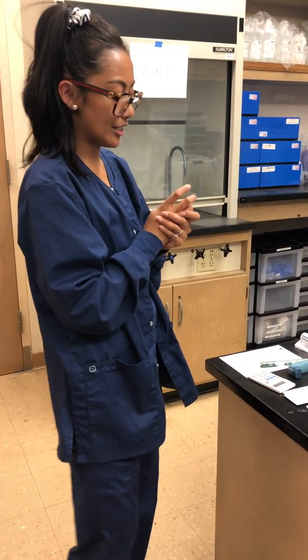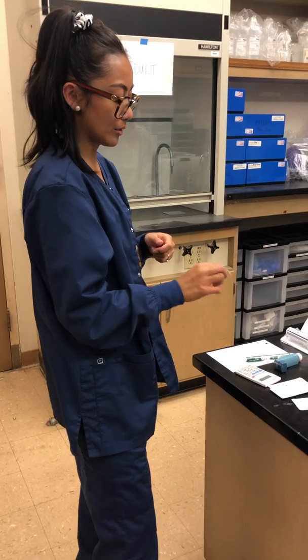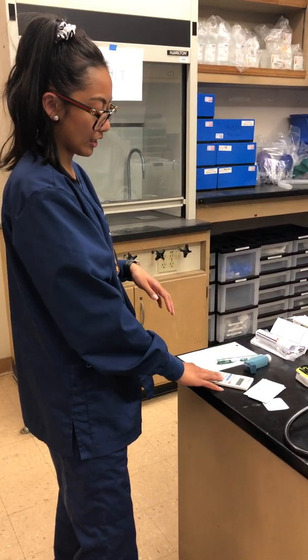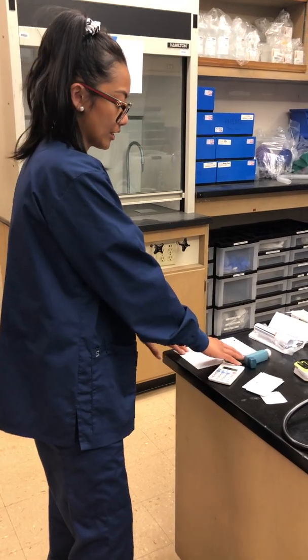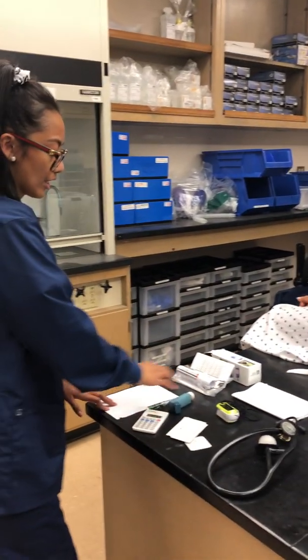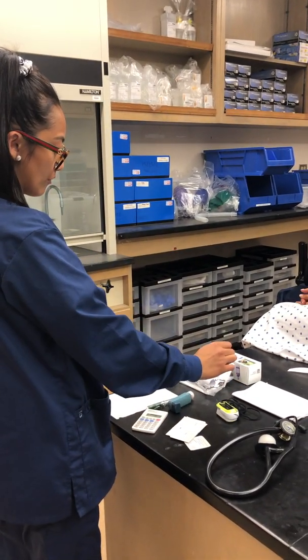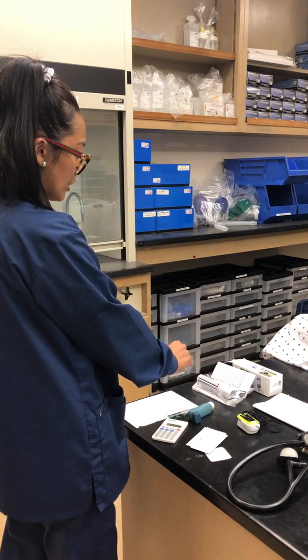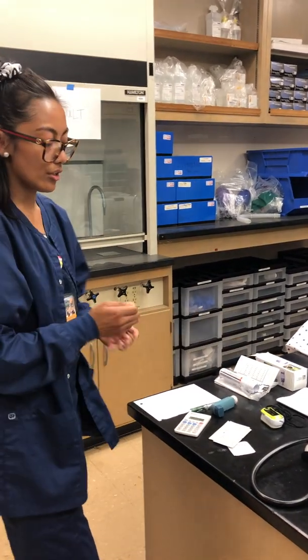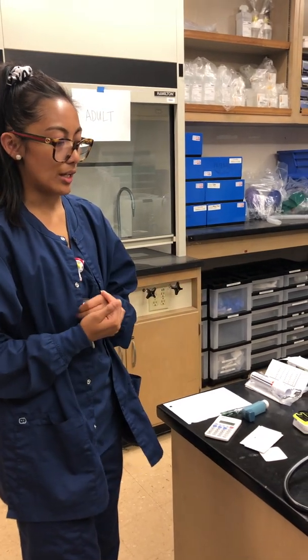And then I would need my stethoscope, pulse ox, metered dose inhaler, some alcohol pads, calculator for my calculations, pencil, a blank piece of paper to record any findings, a napkin for my patient to cough, the peak flow meter, and a spacer or chamber. Also a set of gloves and some hand sanitizer.